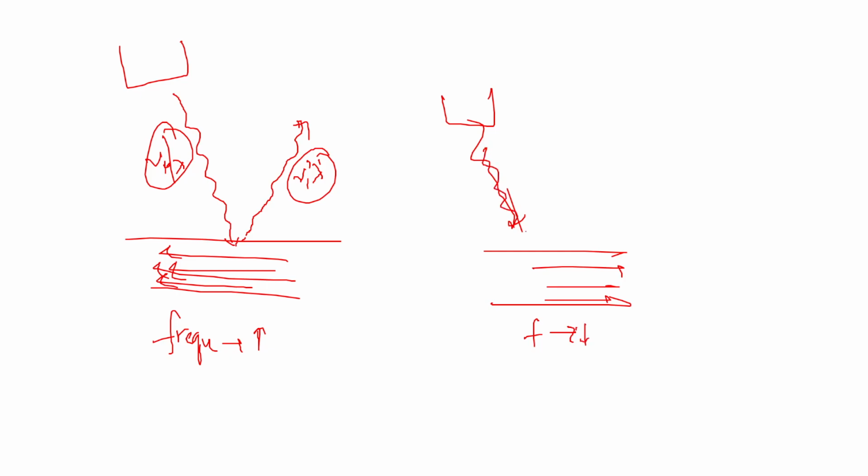This is the way that the initial ultrasound waves are going, and if the object is moving away from the source, the frequency will decrease. If the object is moving towards the probe, the frequency will increase.